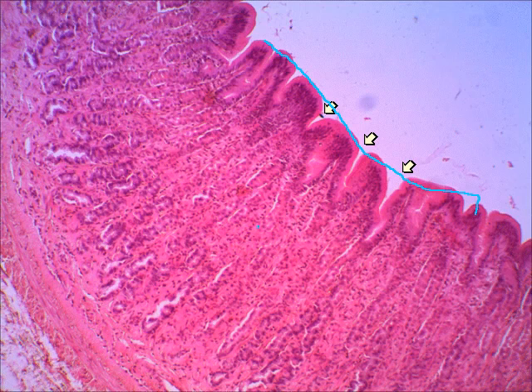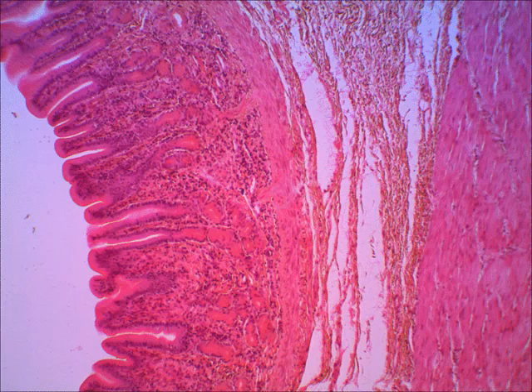The gastric glands, you can see all through the mucosa in here. You can see all of this is gastric glands. Look at the drawings in your lab book and in your textbook, and you'll see those gastric glands more easily. If I move to another slide of the stomach, if we wait till it moves, I'm sorry again, it takes so long to get from one to the other.